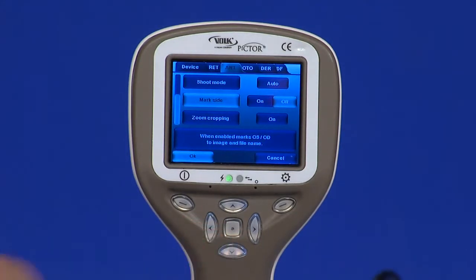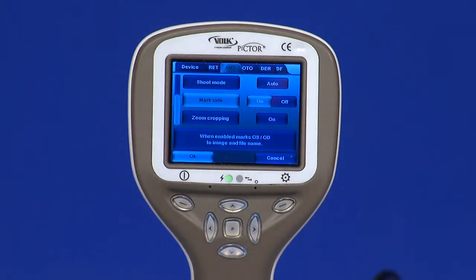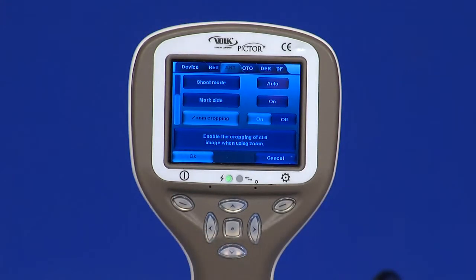Mark side: it is possible to mark which eye was imaged. When switched on, the side is marked to the file name and to the image. For video files, the side is always marked only to the file name. When marking side is enabled, the camera will ask to confirm which side after each captured image. Identifiers used for eye images are OS for left and OD for right.